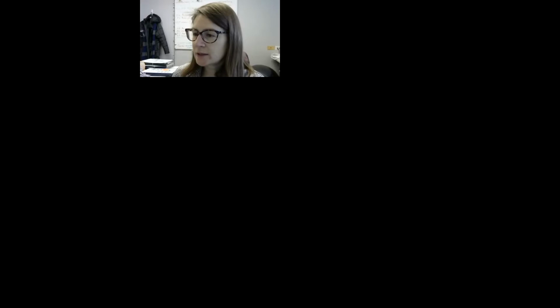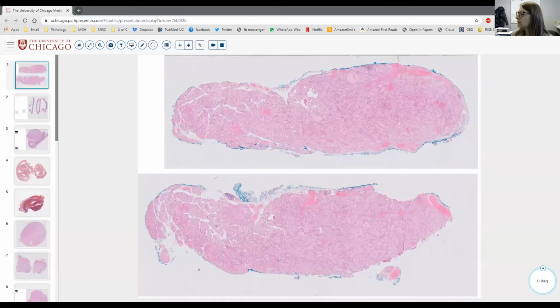So we're nearing the end of our ENT block, and I know we've had the sort of didactic overview on thyroid. And so hopefully this more interactive virtual microscopy on thyroid will answer some of your questions, feed you some more information.